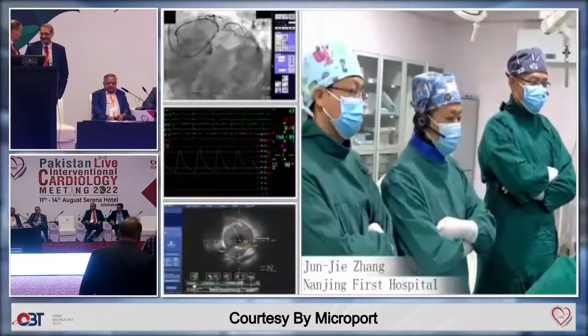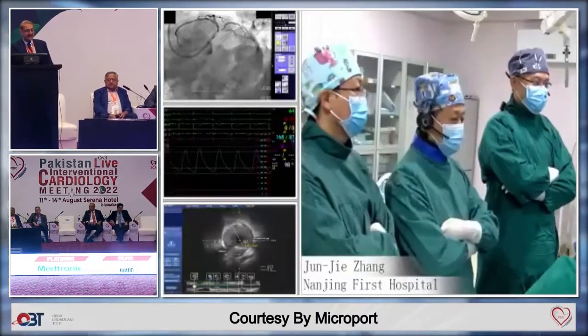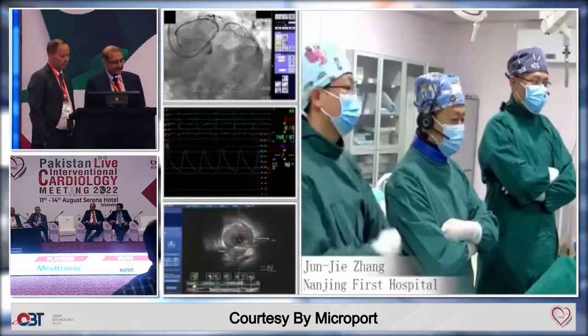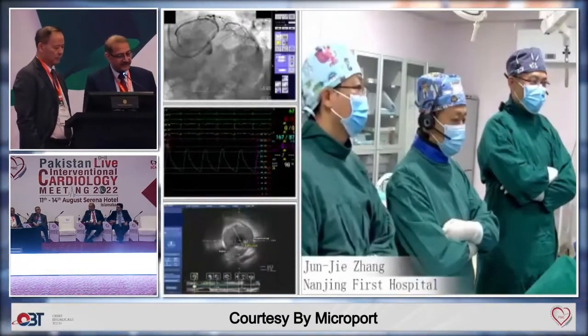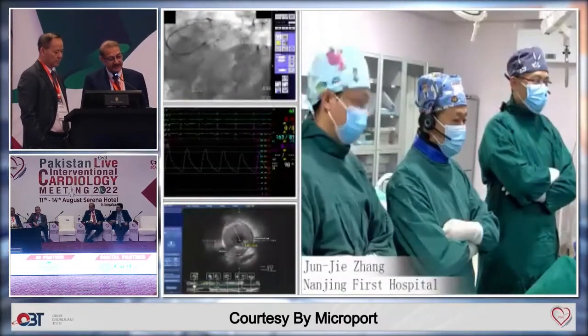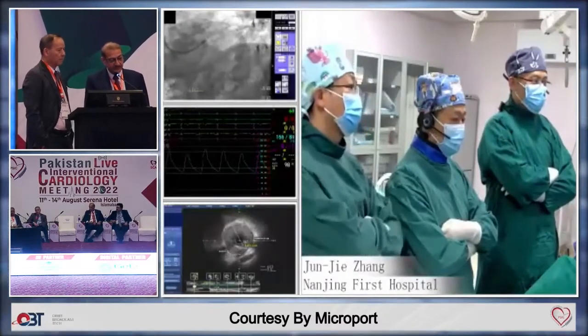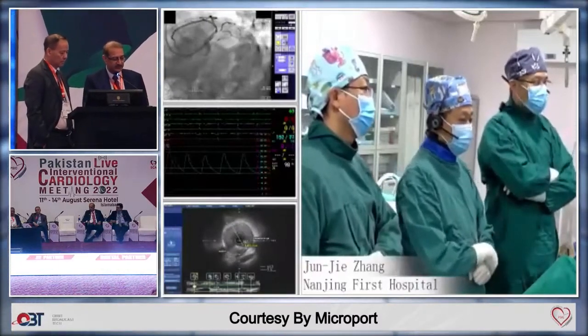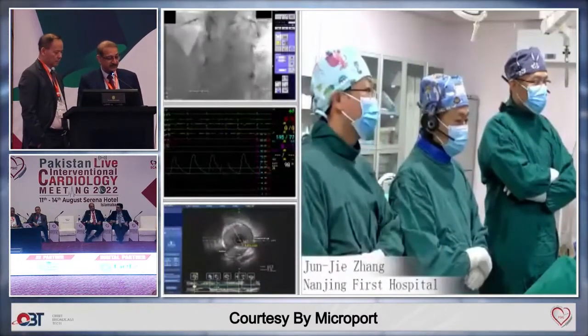Right, very nice case, very educative. It's a trifurcation anatomy, complex lesion. And one thing which I see is the OM branches at a right angle, so hopefully it doesn't look to be ostial disease. So probably one suggestion is that we do just 3 wires, but maybe 1 or 2 stents.